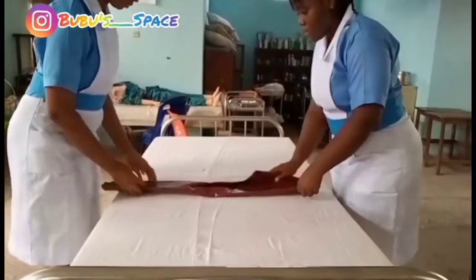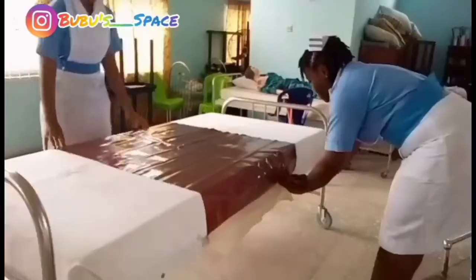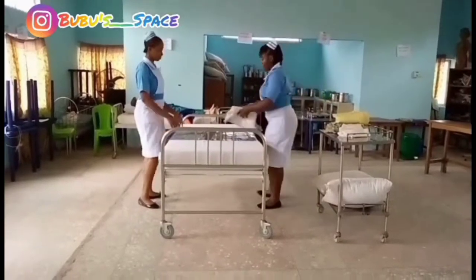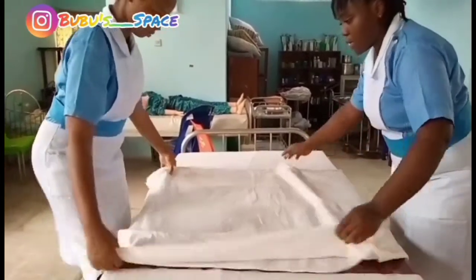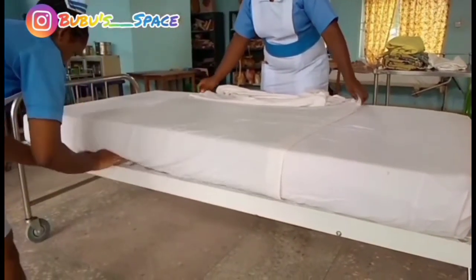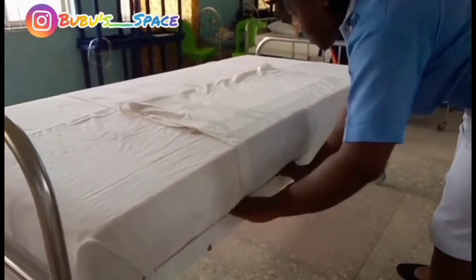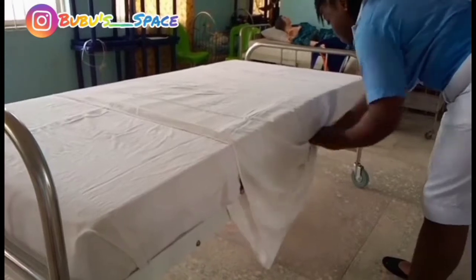We are going to be needing a lot of equipment to support this bed making. Right now we are almost done with the foundation bed. The foundation bed is the level at which other beds are made upon. So whenever you reach the draw sheet in the OSCE examination, just say that this is the foundation bed upon which other beds are made.